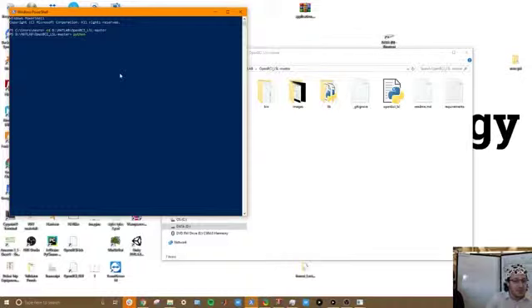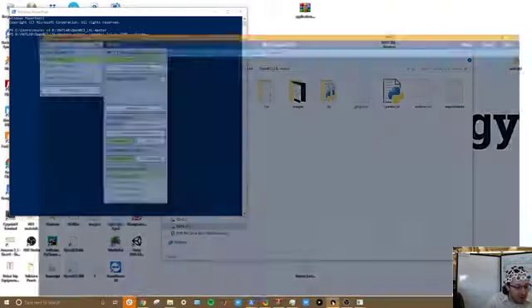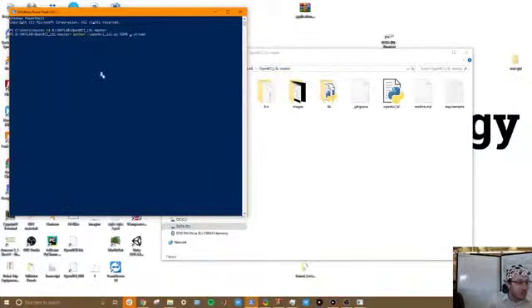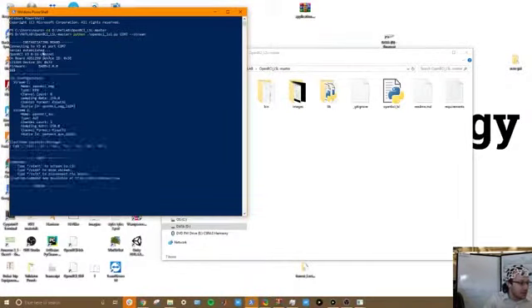And you have to make sure you have some libraries installed. They're in the requirements document, but their website also describes what you need for this. I think I actually have this preset, yeah. And just to verify which COM port I'm on, COM7. So if I'm on COM7, I have to change this text. So it says COM7 stream. And now it should set up a stream. It's established a serial connection.